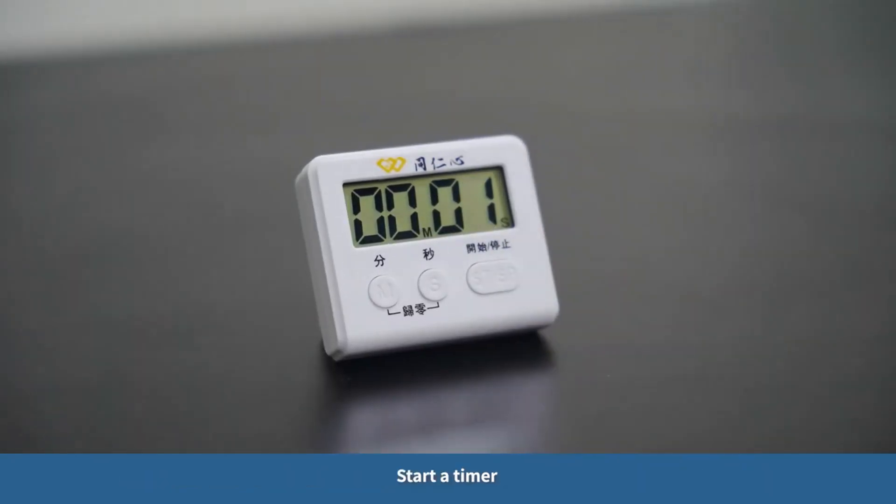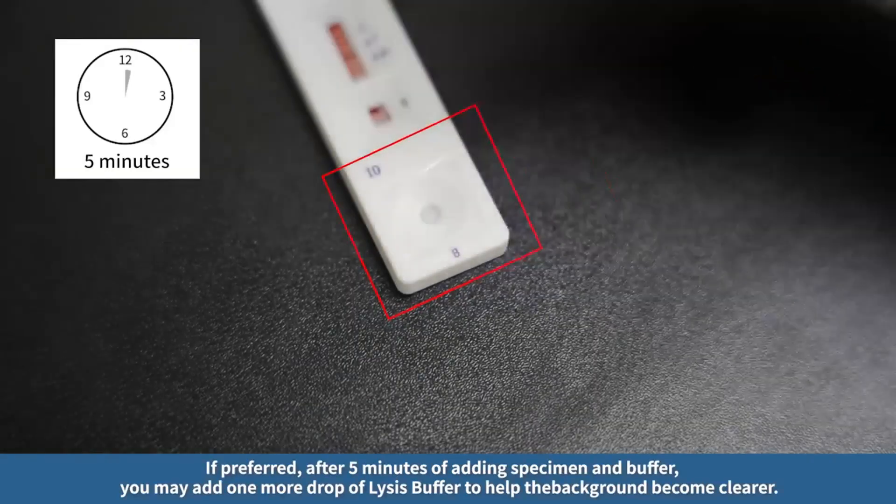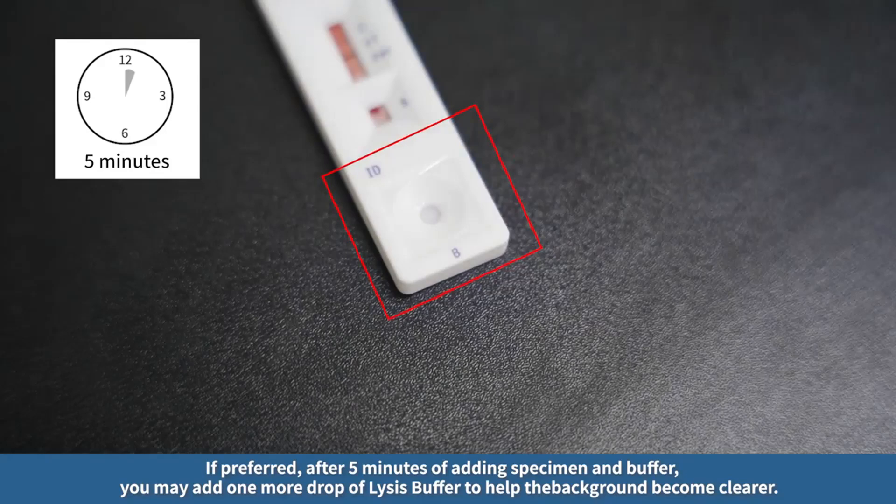Start a timer. If preferred, after five minutes of adding specimen and buffer, you may add one more drop of lysis buffer to help the background become clearer.